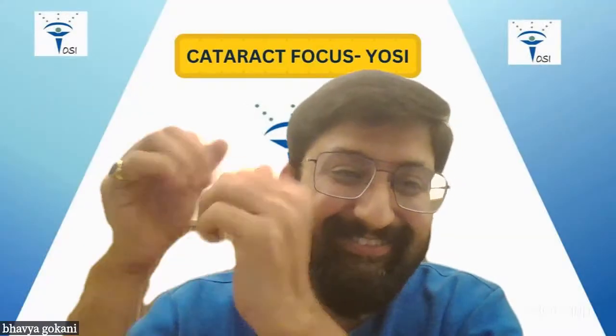The second important point is the position of the side port incision. It has to be at the limbus, not in the clear cornea. What happens if you move it very far into the clear cornea, because you're fearing conjunctival chemosis, which can happen if you make it at the limbus? First of all, you're making a large 1.5 millimeter incision.